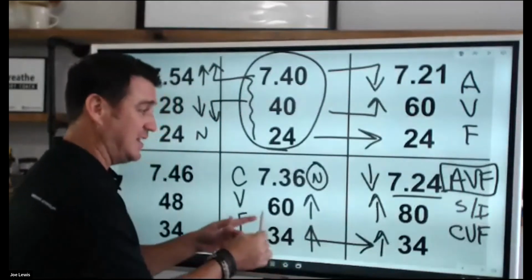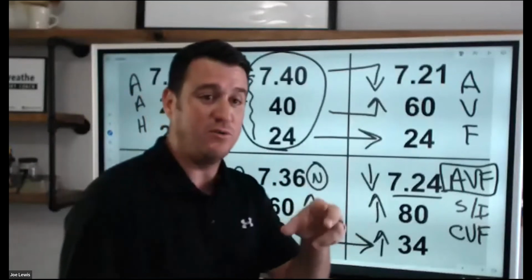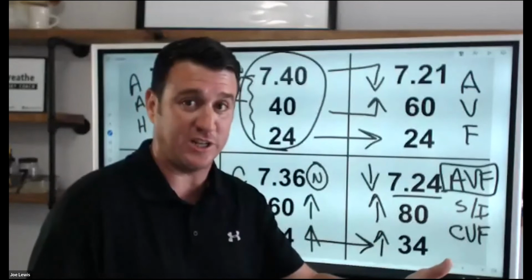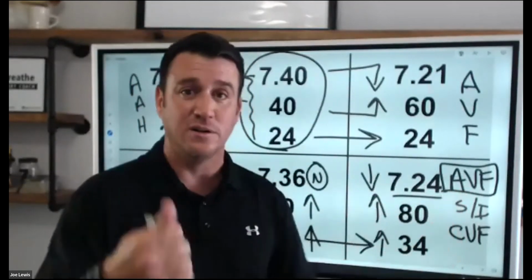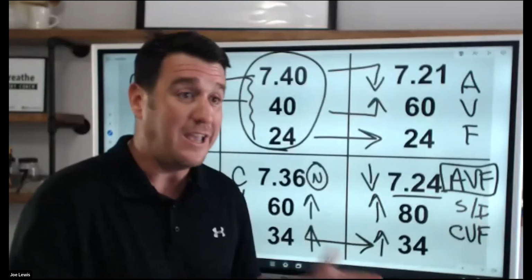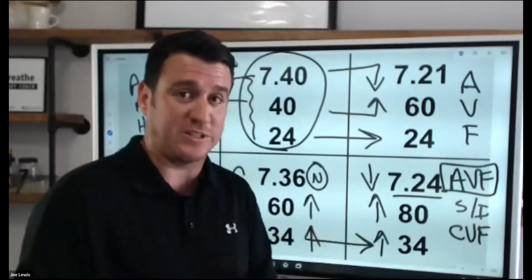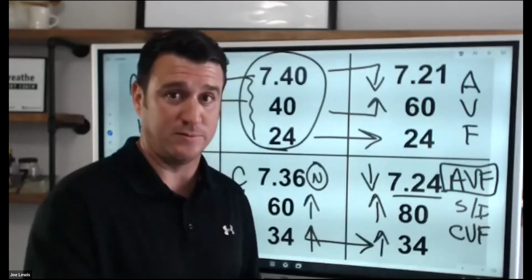Fully compensated respiratory acidosis. You see, anytime you use the word respiratory in your interpretation, you need to ask yourself, is this acute alveolar hyperventilation, chronic vent failure, acute vent failure? Maybe it's acute vent failure superimposed on chronic vent failure. Anytime there's a respiratory disturbance in your interpretation, these advanced terms are applicable.